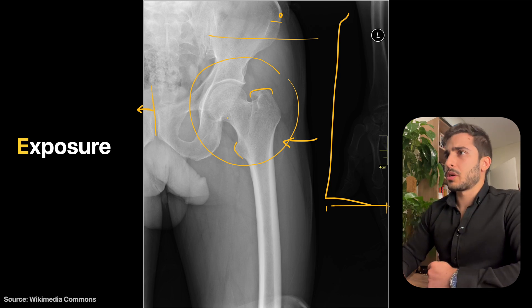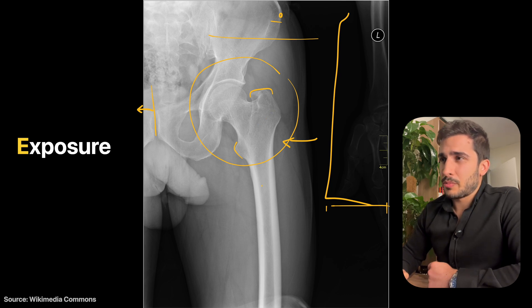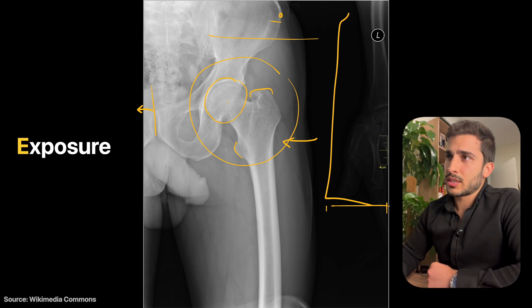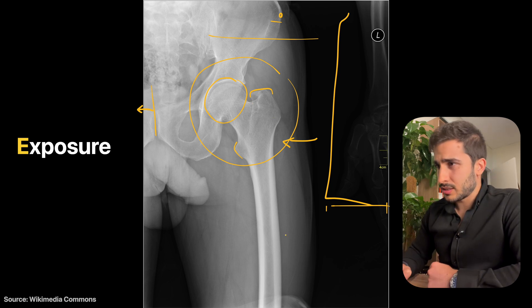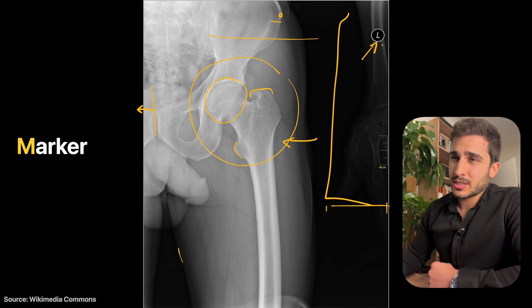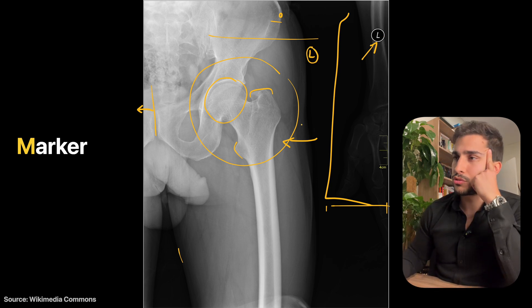Exposure is quite good in this case. The brightness is a little high, which could be fixed in post-processing. KVP could be slightly improved to increase penetration, but it's not really necessary. You can see the bone texture quite nicely, particularly in the femoral head, and soft tissue detail is good down below. The left marker is correct but is placed a little too far out — bring it closer to the anatomy, either top or bottom.